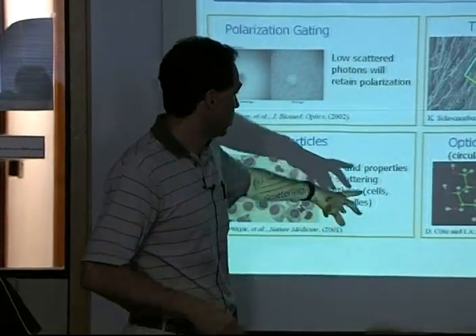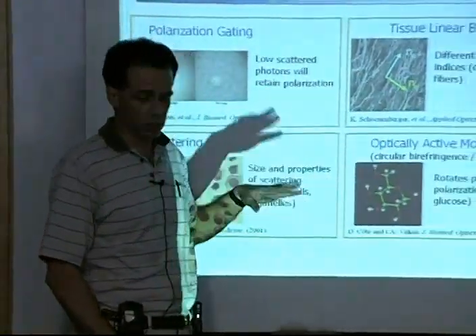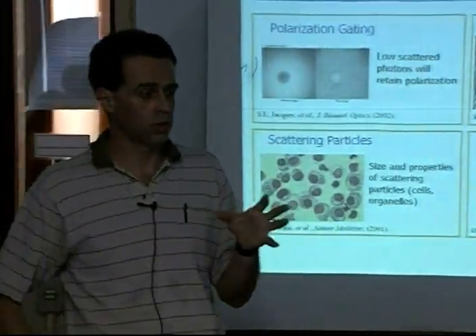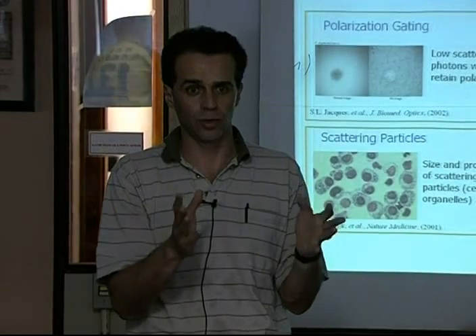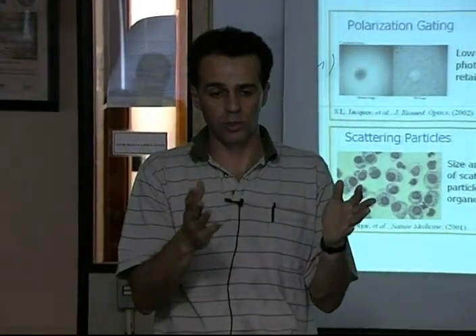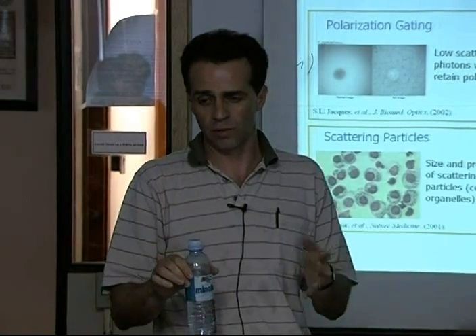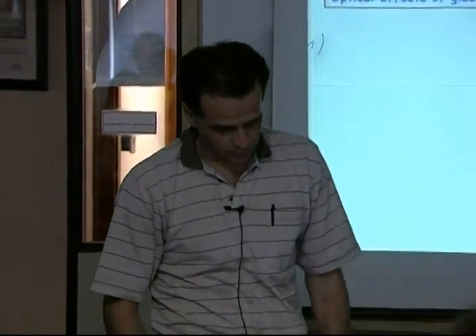And this is the one that we'll concentrate a little more on. I guess these two, but this one is specific, which is looking at this optical activity, the ability of the glucose to change the linear polarization state. And does that hold in a tissue medium, in a turbid medium? We know it holds in a transparent medium. That's really of limited use in biomedicine. So we'll see if that works.